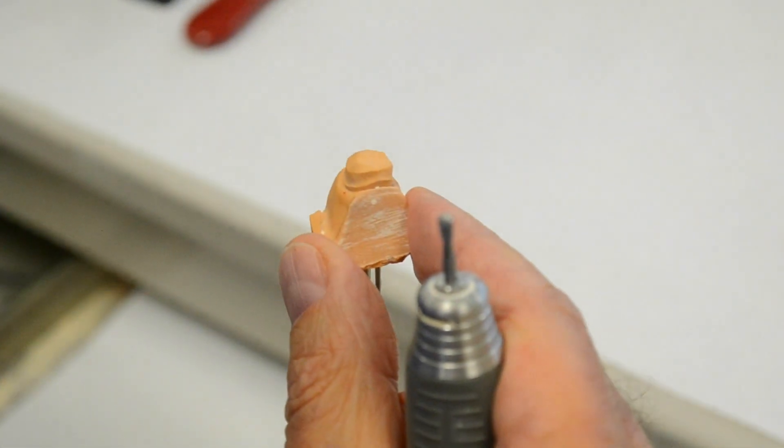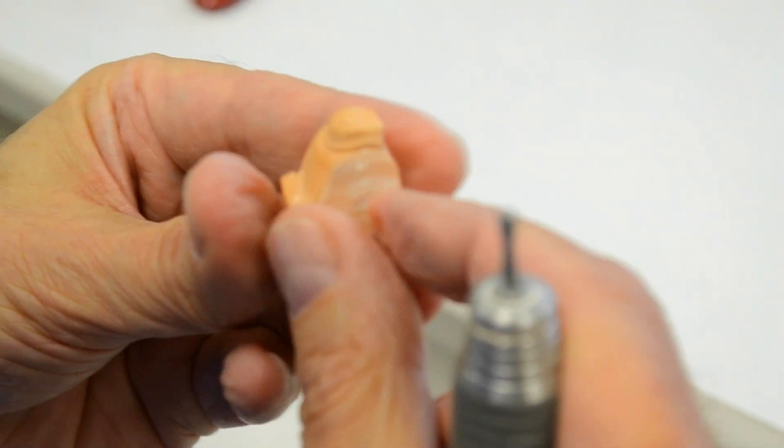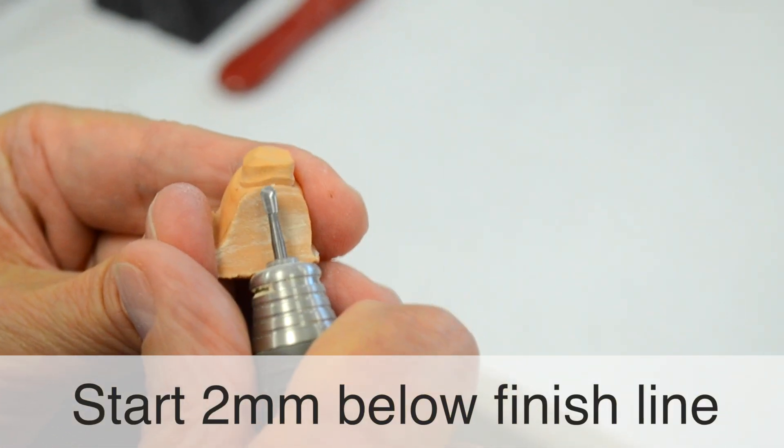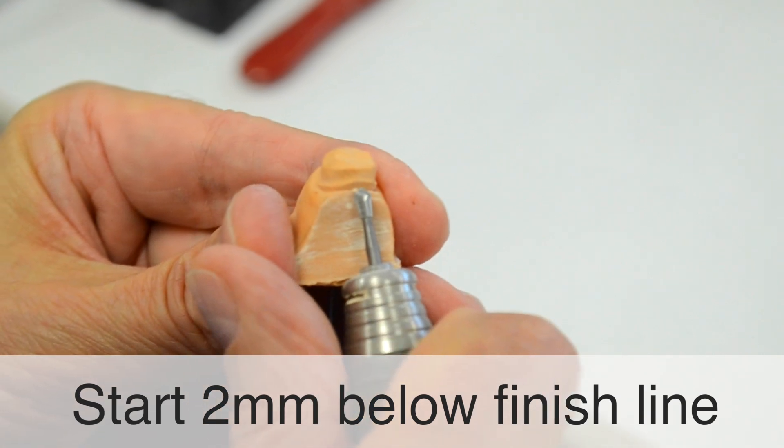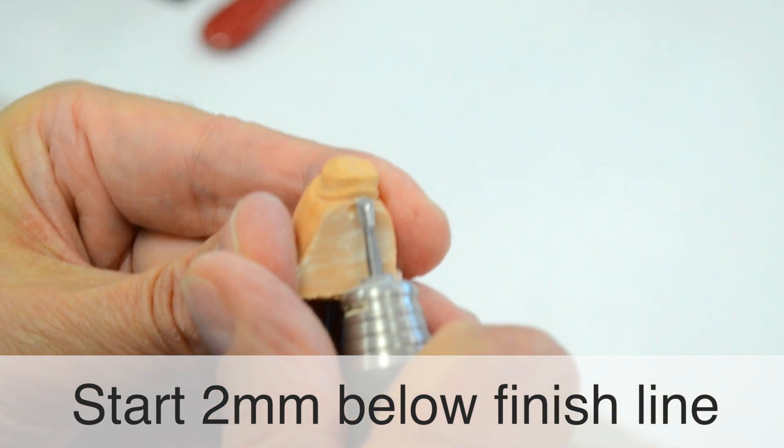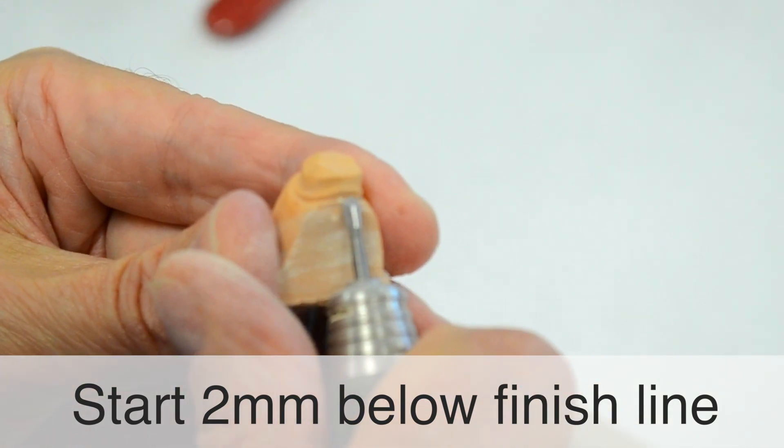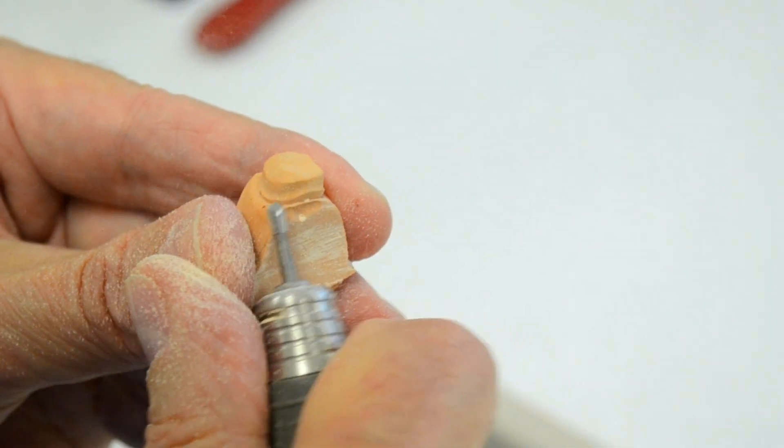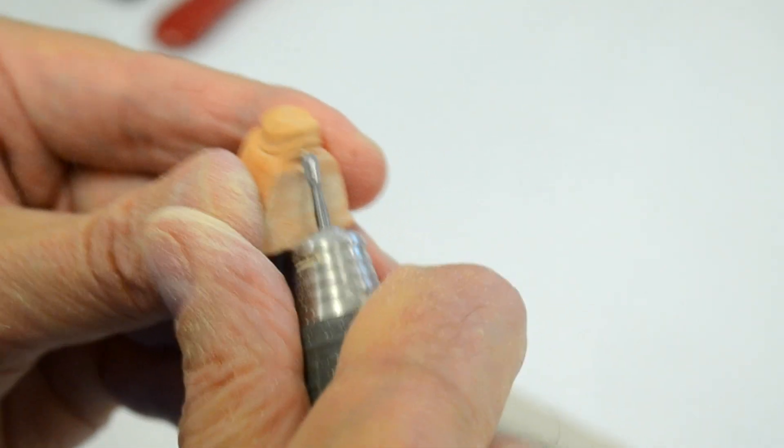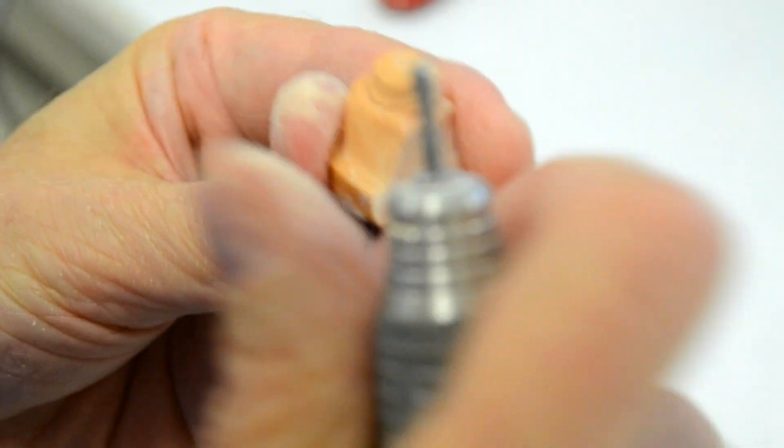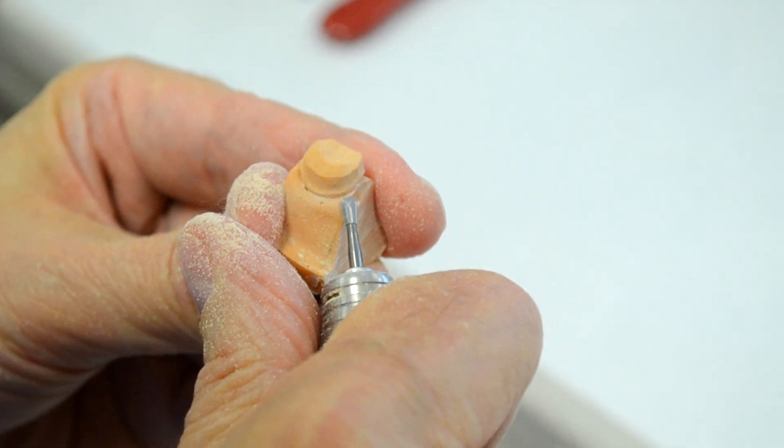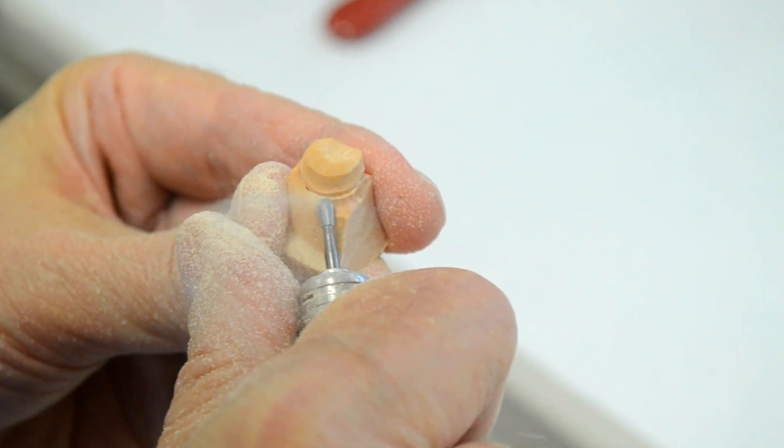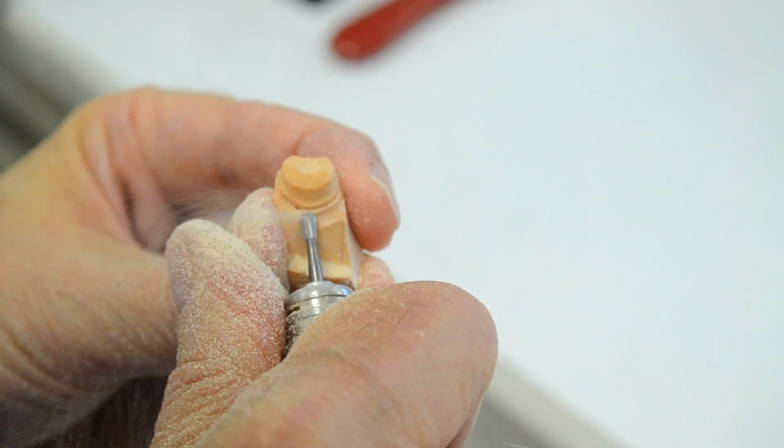We're going to begin using magnification. We're going to begin the die trimming process. We'll start trimming the die at approximately two millimeters apical to the finish line, and we do that simply by applying light pressure and a good finger rest, thumbs resting against one another. We slowly engage the burr, remaining all the while at least two millimeters below the free gingival margin.